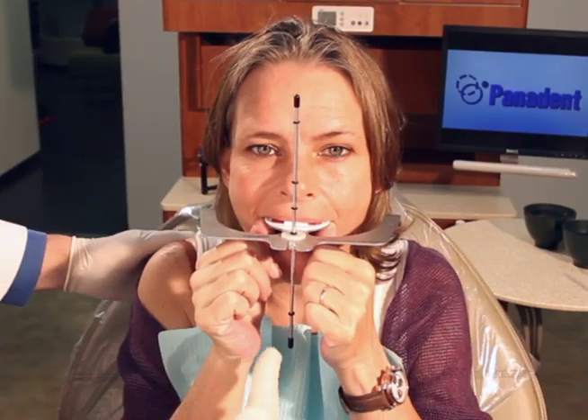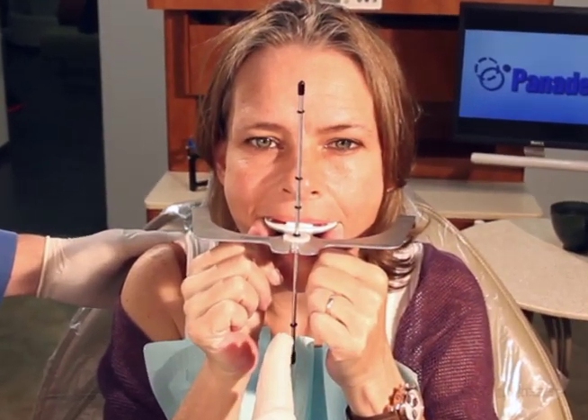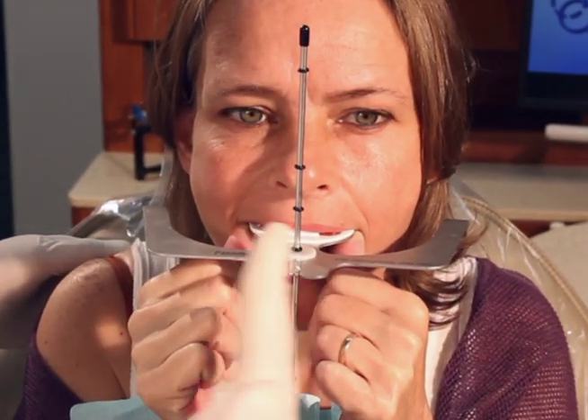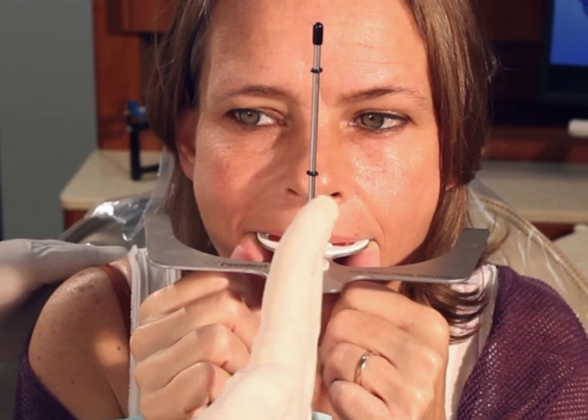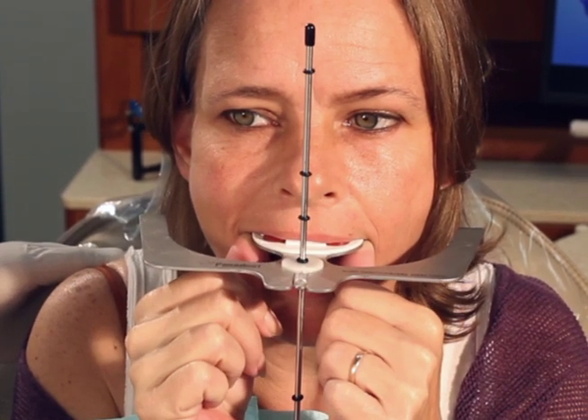This is the critical aspect: getting the vertical rod to facial midline so we can see where our dental midline is in relationship to facial midline, but more importantly, whether we have a cant in our dental midline in relationship to the facial midline.